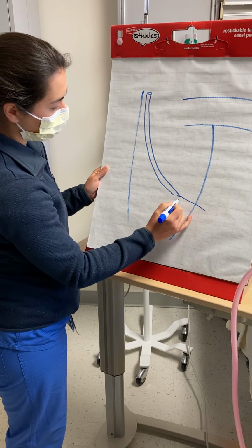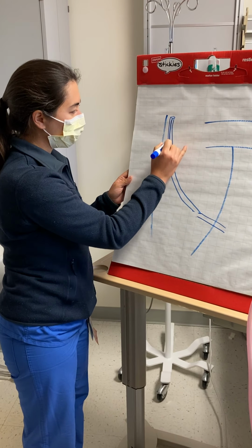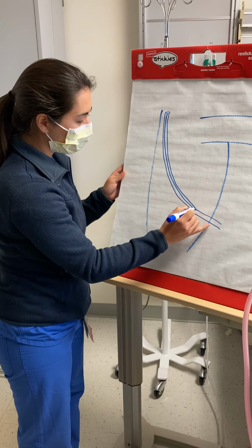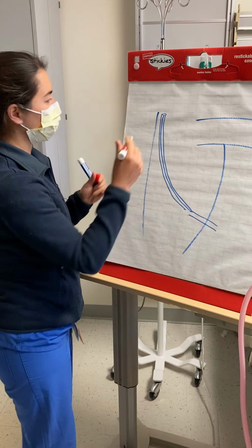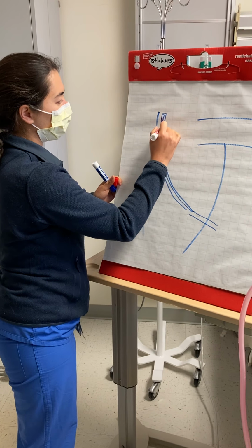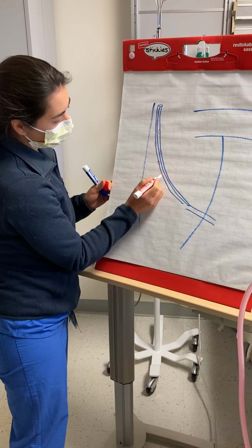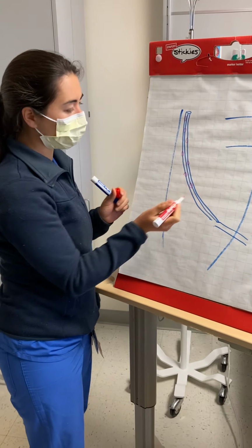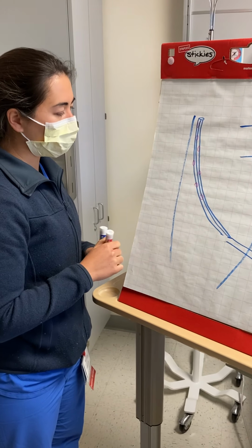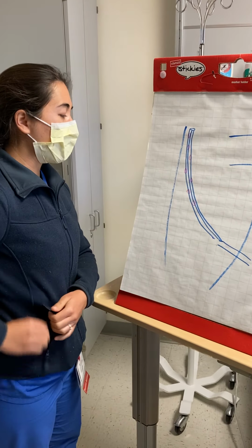And then, like last time we talked about taping it more anteriorly, there's normally a radio-opaque line on the chest tube, and then we normally have drainage holes that are added on. So, you know, they're kind of like this. One important thing to note that we'll come back to later is that whenever we cut extra drainage holes, the last one is always on a radio-opaque line. And that's going to be important later for figuring out where an air leak might be coming from.